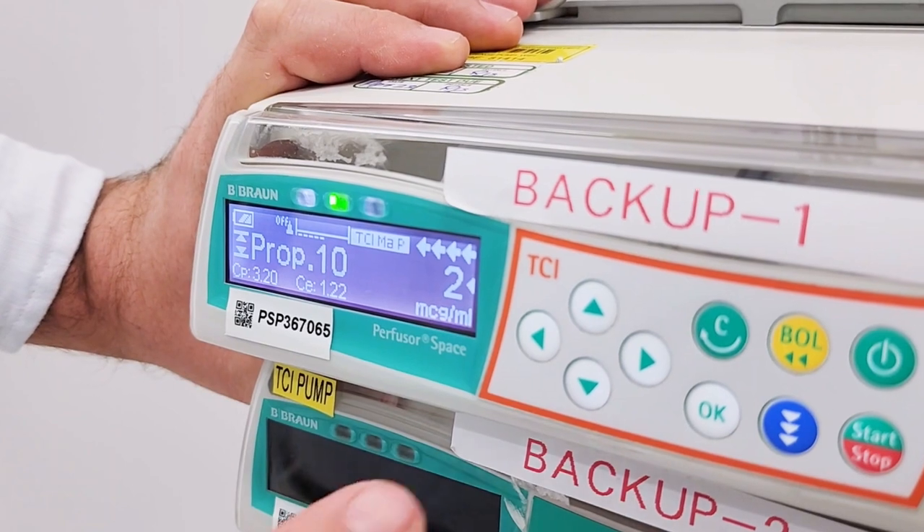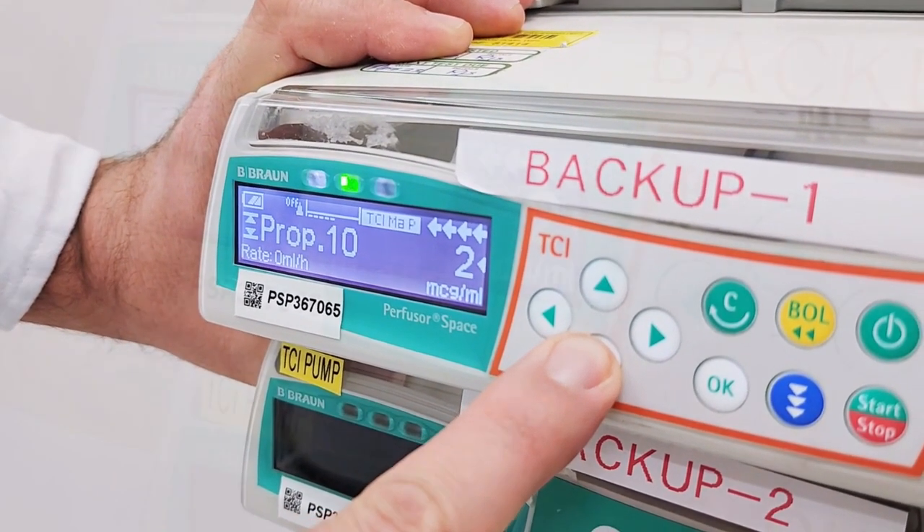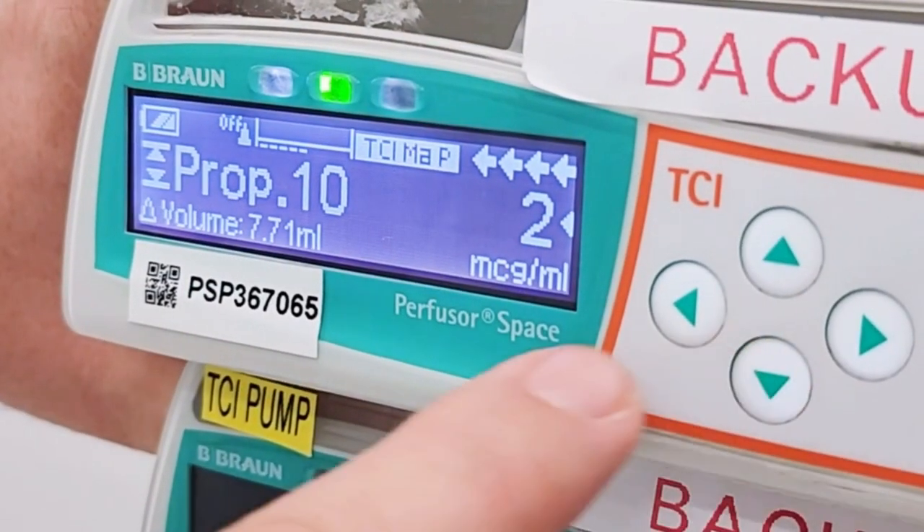You can see the infusion details by pressing this down arrow. Use the arrow down to check other data such as volume and amount infused.